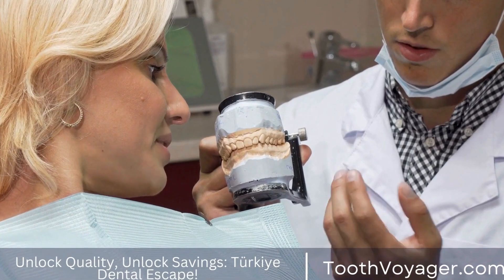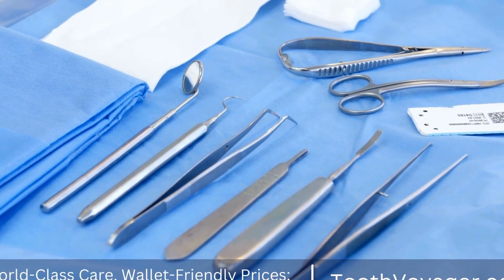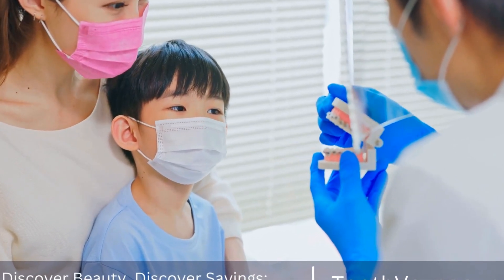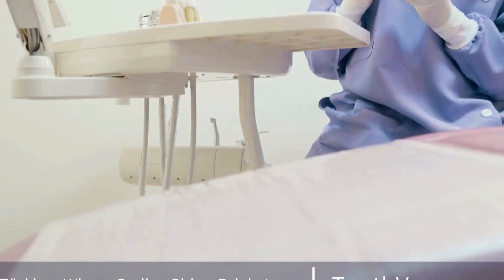Initial consultation. The first step towards getting a dental bridge is to set up an initial visit with your dentist. At this time, your dentist will review the condition of your teeth and go over possible options to replace the lost tooth. Additionally, they will collect x-rays as well as impressions of your teeth to ensure a perfect fit.